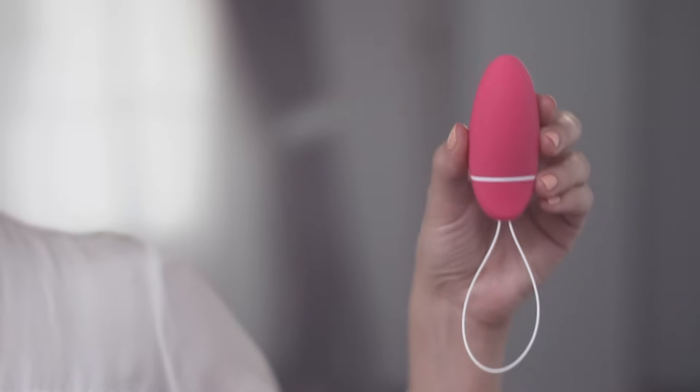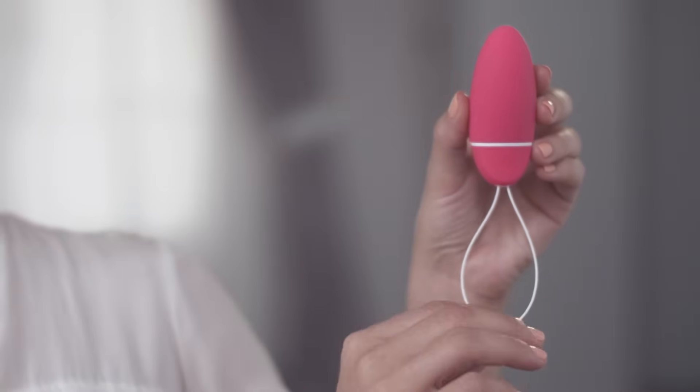Once Kegel Smart is on, you'll have 30 seconds before the routine starts. Insert Kegel Smart into your vagina. It should be positioned just within the opening with the string outside.